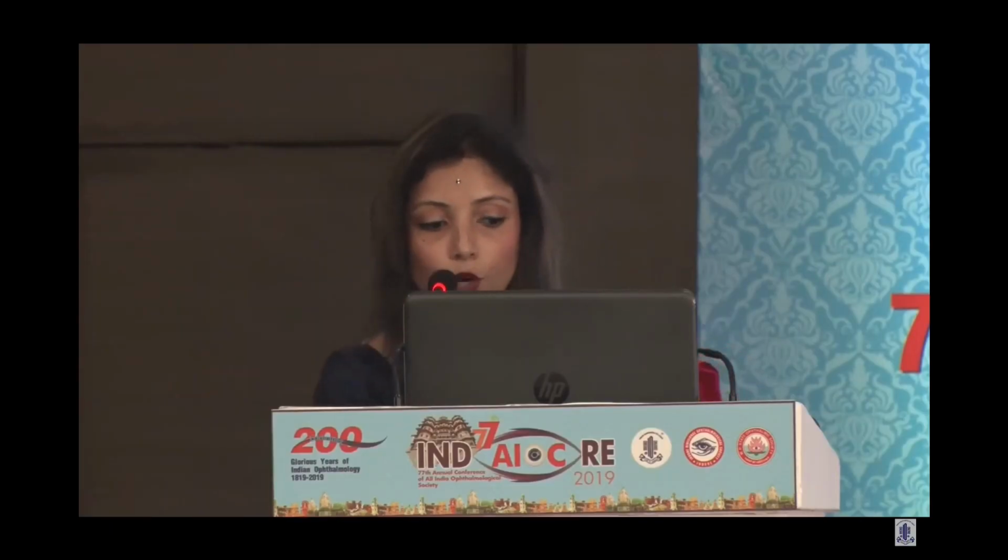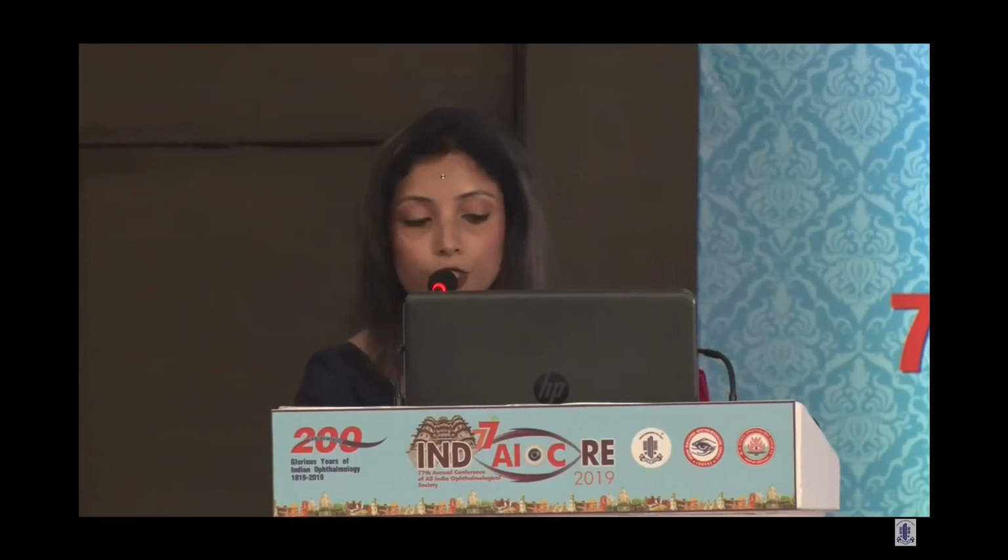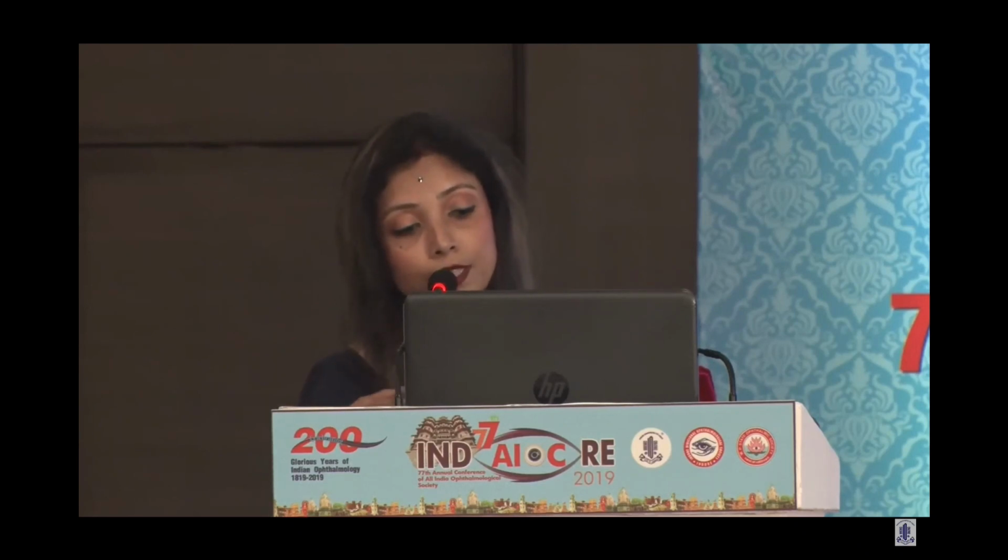We have a lot of hollow instruments in our vitrectomy and phaco machines. All the hollow instruments, the irrigation aspiration cannula as well as the phaco handpiece, need to be flushed with distilled water 3 times. That flushing, as you can see here, is being done with a 60 cc syringe and not a 10 cc syringe. Thrice we'll flush with distilled water, we'll throw that distilled water, and thrice the flushing will be done by air. So that makes a 6 times flushing.